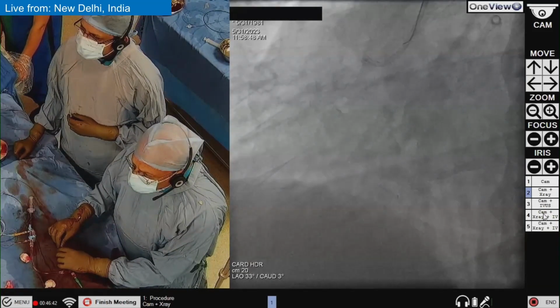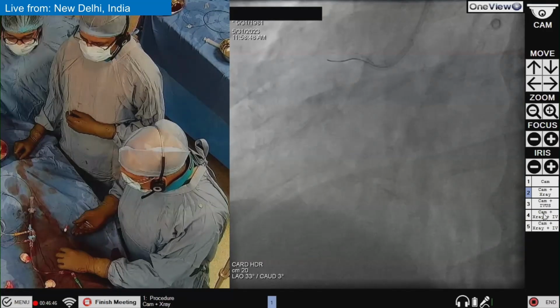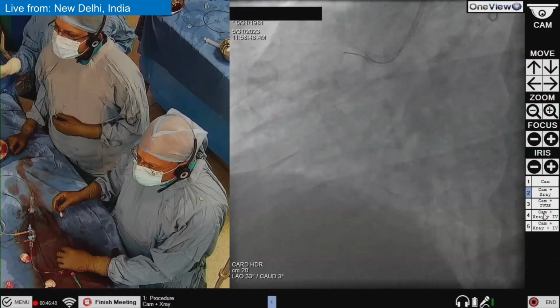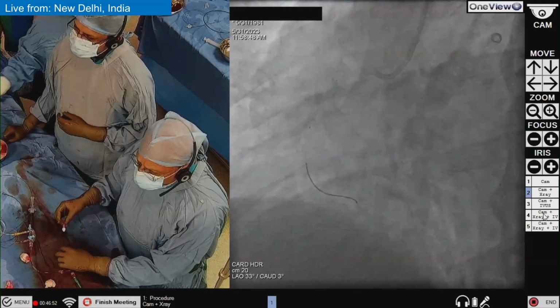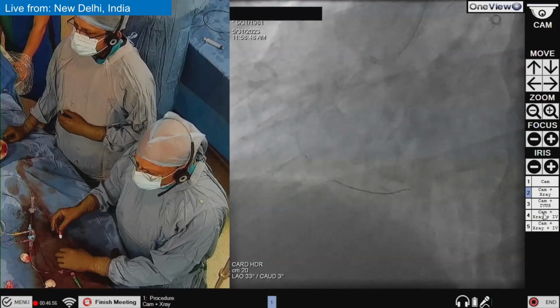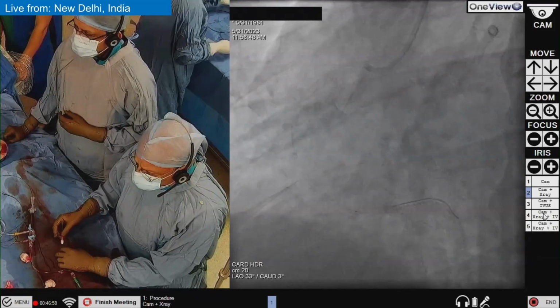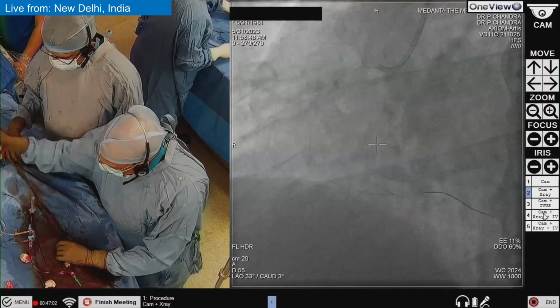Now I will try to negotiate the wire. Very small branch. Okay. So we are in a reasonable branch.